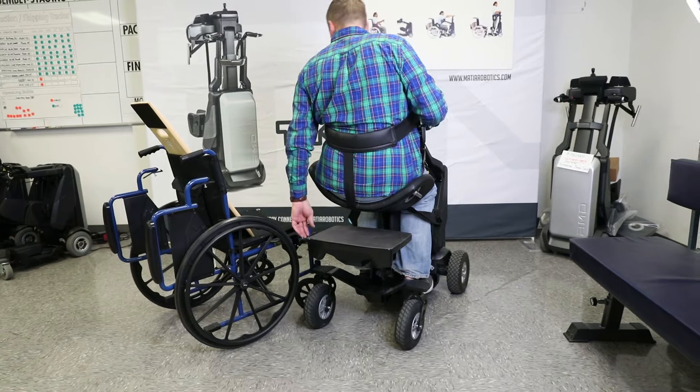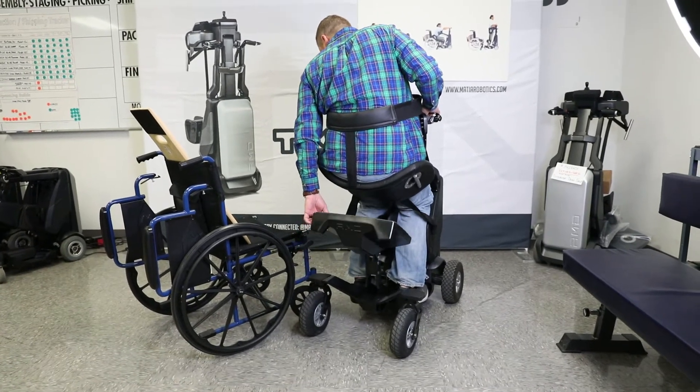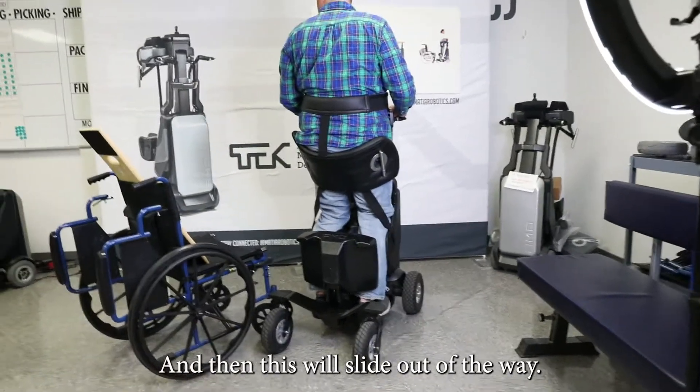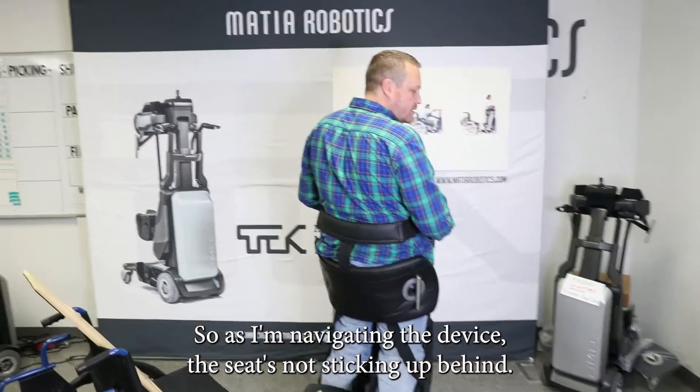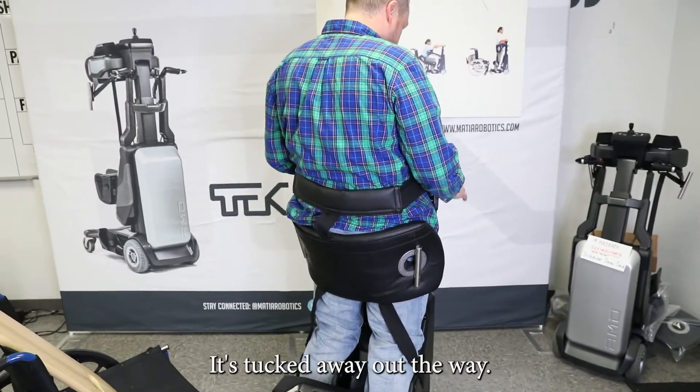Instead of having that seat sit in the way as I start to stand up, I can fold it up and it'll slide out of the way. So as I navigate in the device, the seat's not sticking up behind — it's tucked away out of the way.